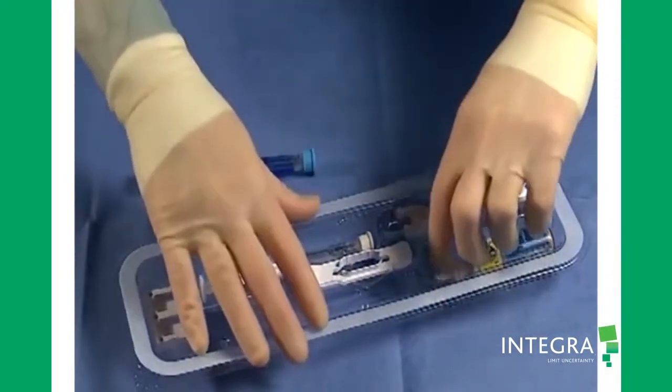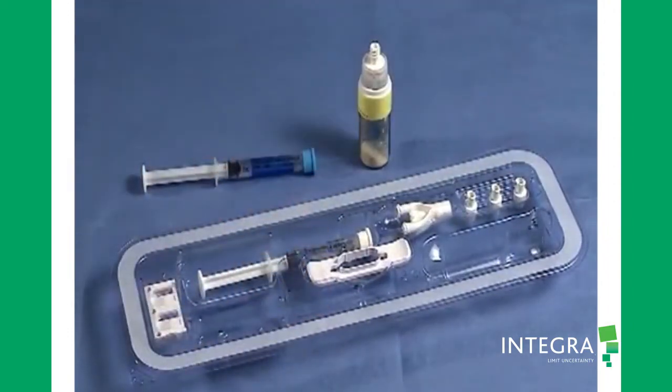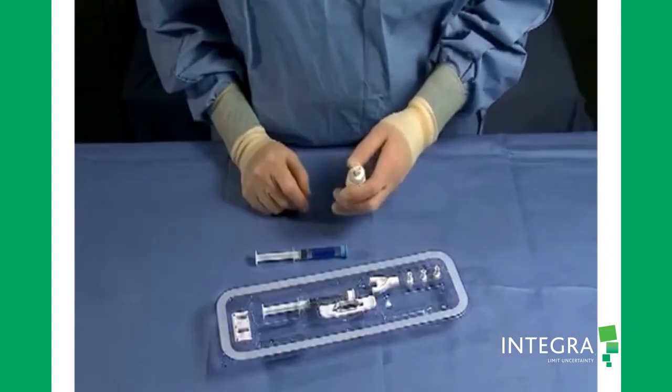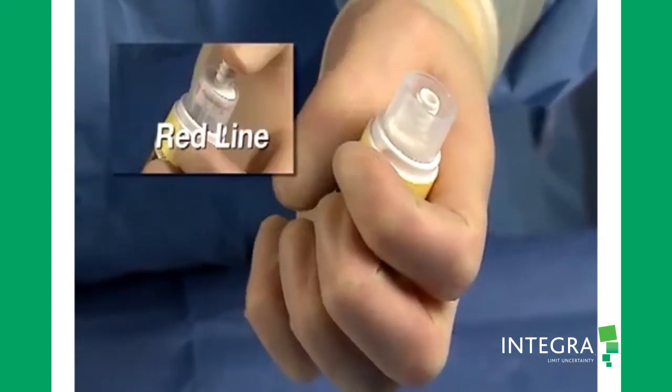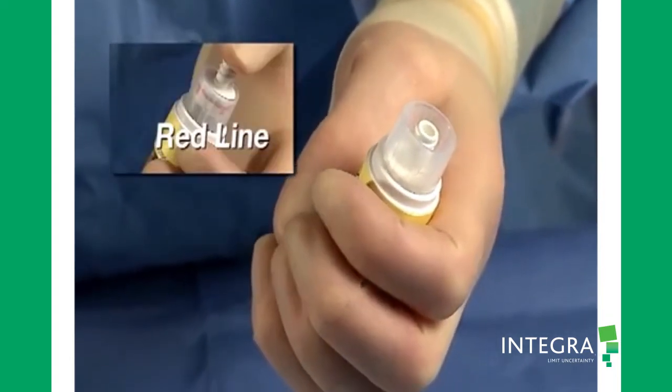Remove the blue syringe and the vial from the package. Push the threaded fitting on the vial until an audible click is heard. Ensure that the red line is no longer visible.